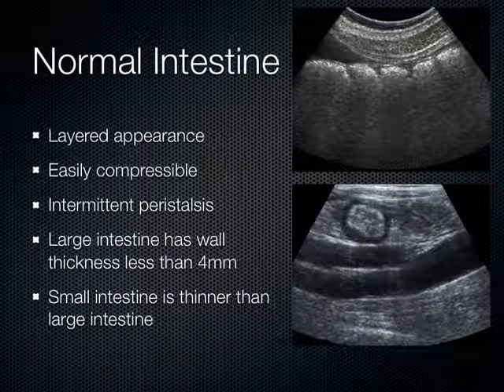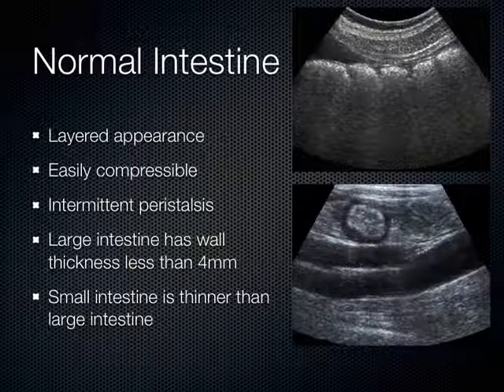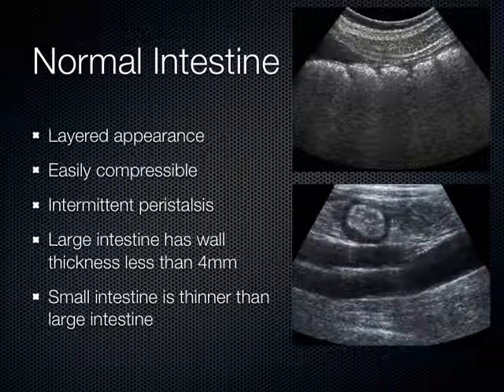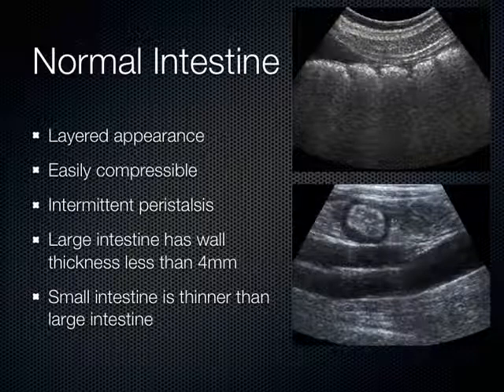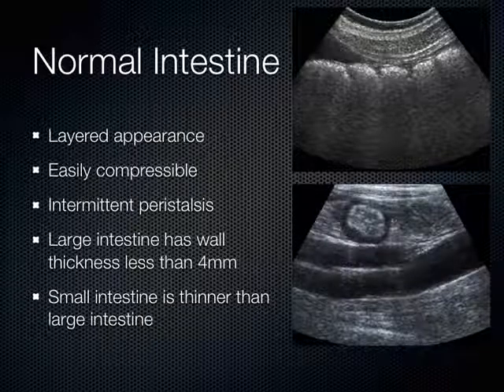Normal intestine looks like this — it has a layered appearance, is easily compressible, and should intermittently peristalse. Large intestine wall is less than 4 millimeters. Small intestine is somewhat thinner — probably closer to less than 3 millimeters, but definitely thinner than large intestine. On ultrasound the colon has that typical haustra, and the right hemicolon is usually filled with stool and gas, whereas the left hemicolon is usually in a somewhat contracted condition.